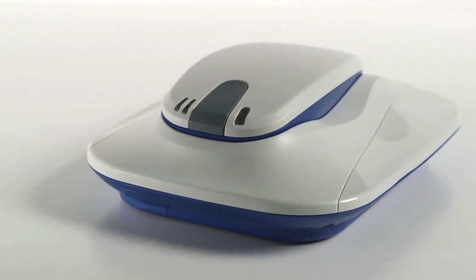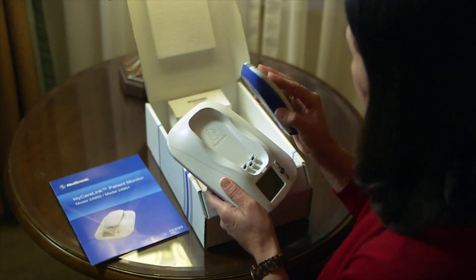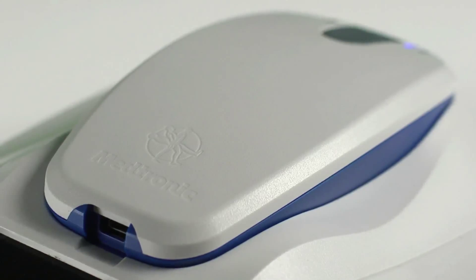The first thing you'll want to do when you get home following the insertion of the RevealLink cardiac monitor is to set up the other necessary component to the system, the MyCareLink patient monitor. Proper setup of the MyCareLink monitor is necessary for the system to work, because this is the only way to move the heart information from the RevealLink to a location where your doctor can review it. The MyCareLink monitor will keep you connected to your doctor wirelessly and automatically.